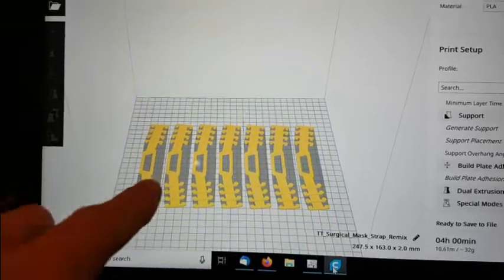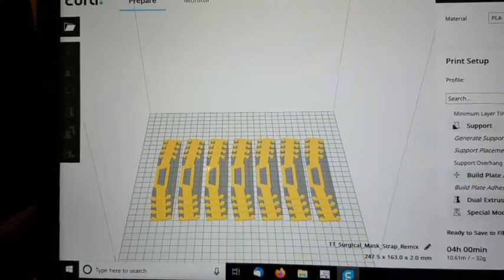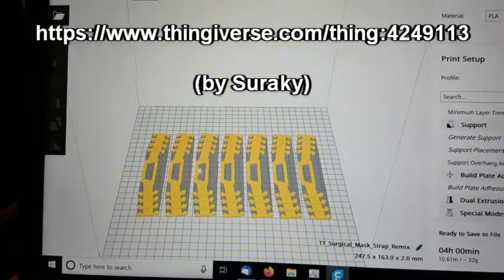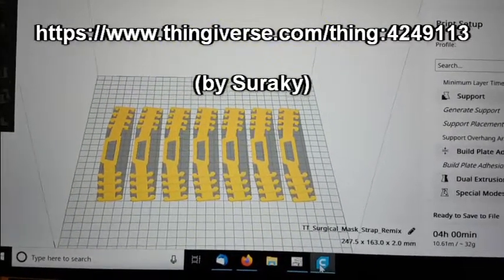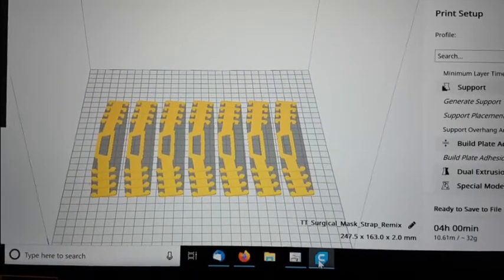What the hell is this? These are face mask holders for doctors and nurses that basically keep the mask elastic off their ears, which sounds silly but apparently it's really annoying. Anyone can print these with a 3D printer.